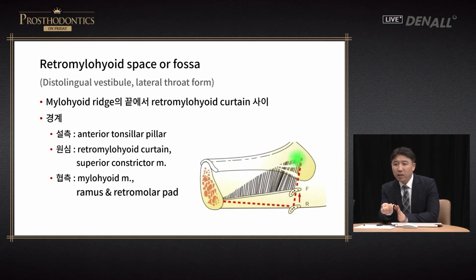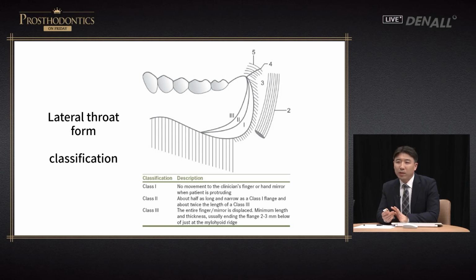Towards the posterior of this area, the muscle attachment ends here. The denture extends beyond that. The length of it is not limited and it can be extended further. We can use the undercut of the mandibular body. This is important for retention of lower denture.